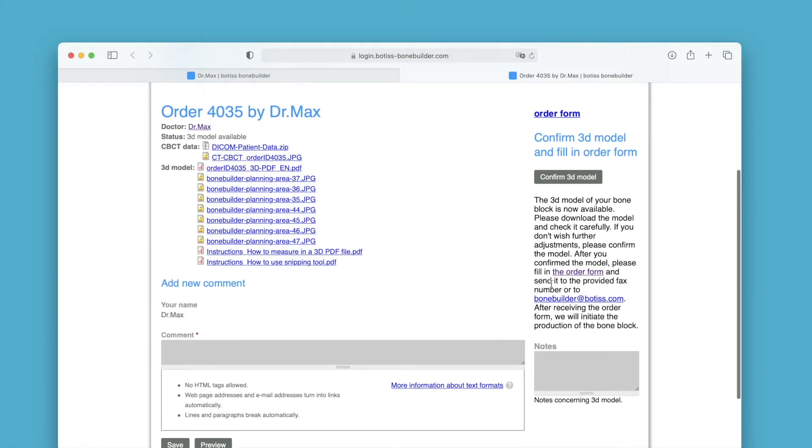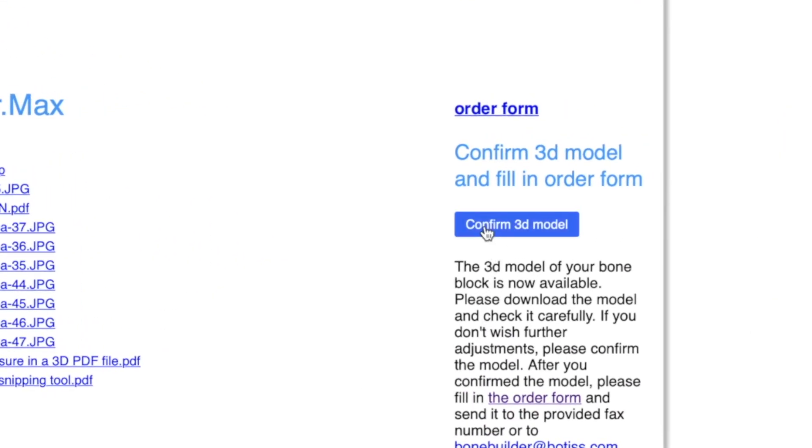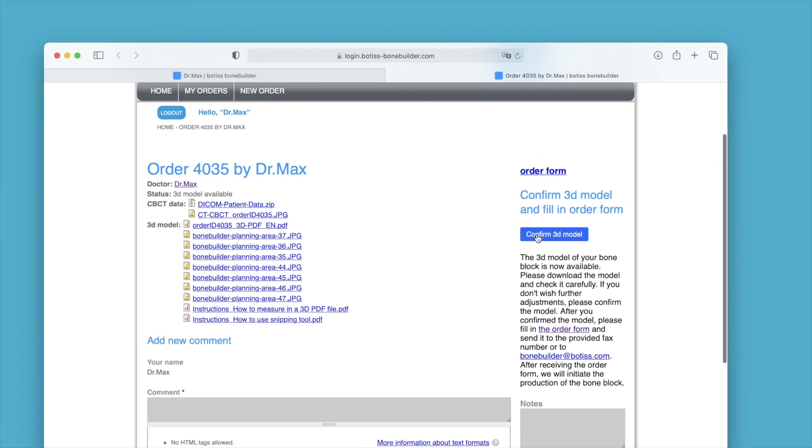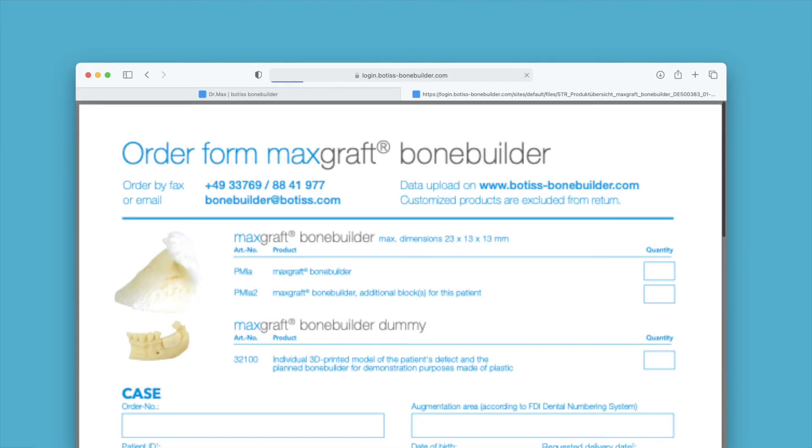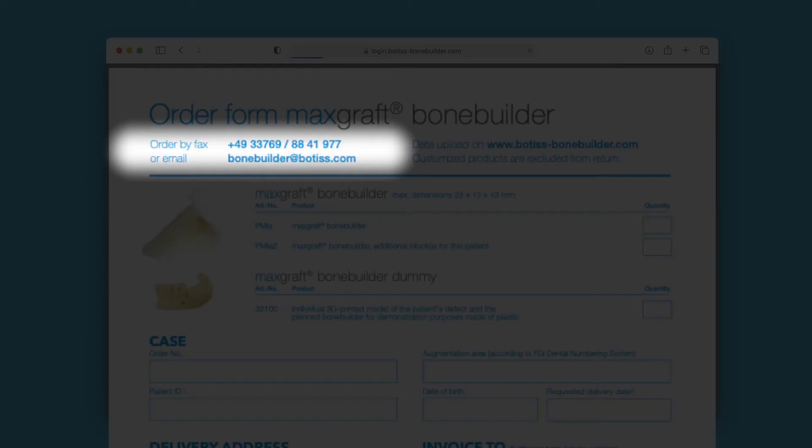You can approve the design by clicking on the confirm 3D model button. Place the final order for your MaxCraft bonebuilder by clicking on the order form button. Fill out the PDF and send it to us by email or fax.